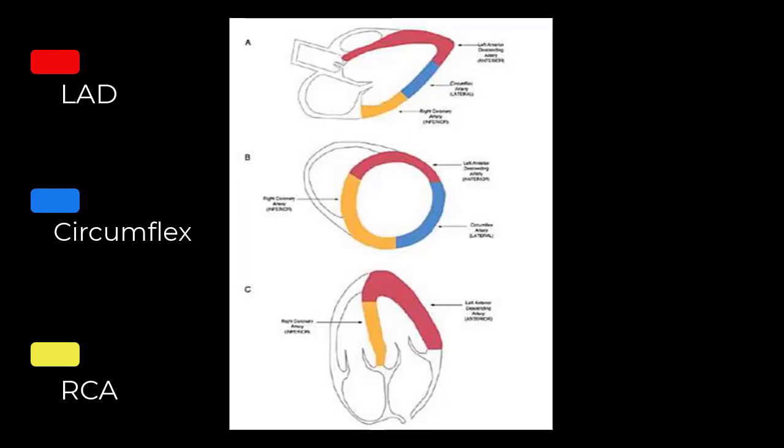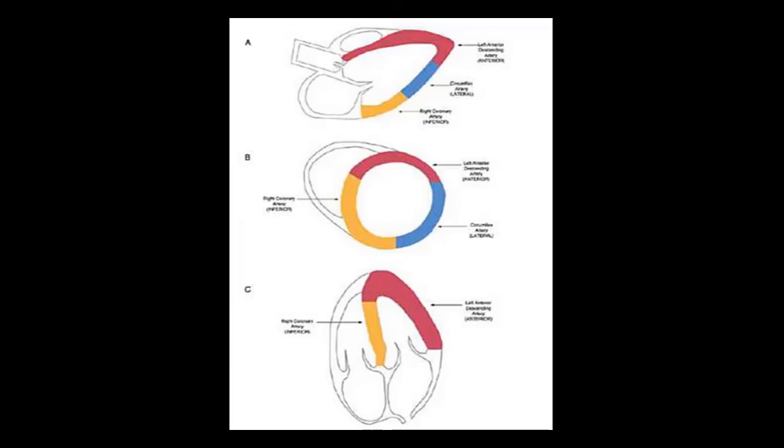When doing a POCUS cardiac scan, we can simplify the 17-segment model into 3 regions that correspond to blood supply from the LAD, left circumflex, and RCA arteries. Imaging in 3 views, the parasternal long and short axis, and the apical 4-chamber should reveal most regional wall motion abnormalities present. To summarize, an anterior RWMA corresponds to LAD occlusion, whilst a lateral RWMA is due to circumflex artery occlusion. An inferior RWMA is due to RCA occlusion.